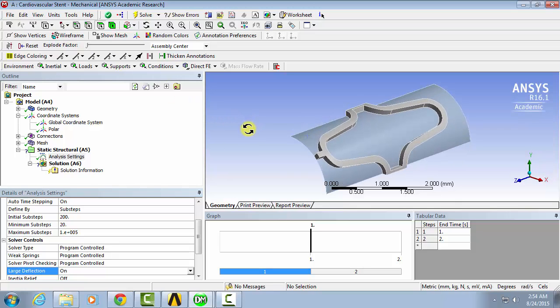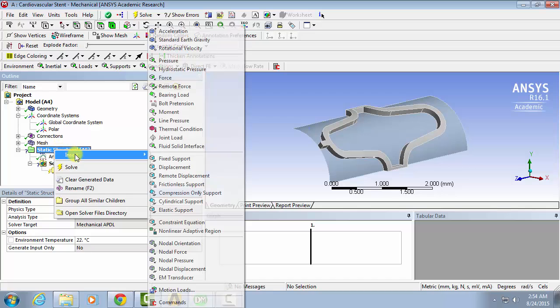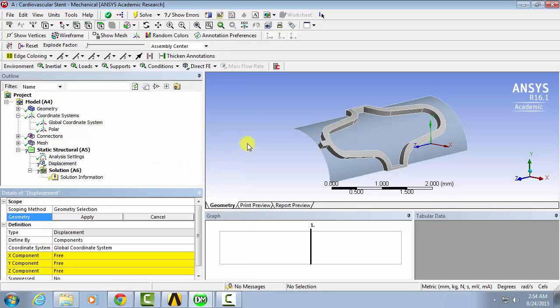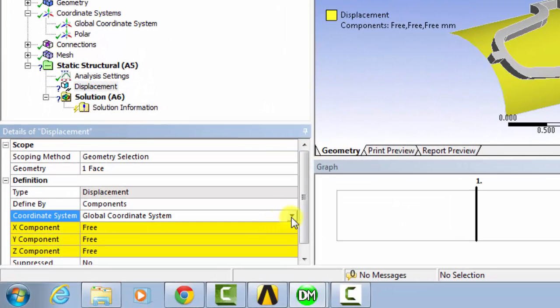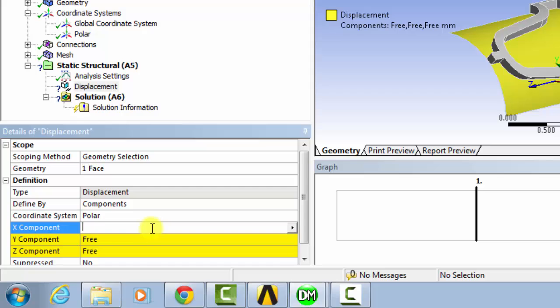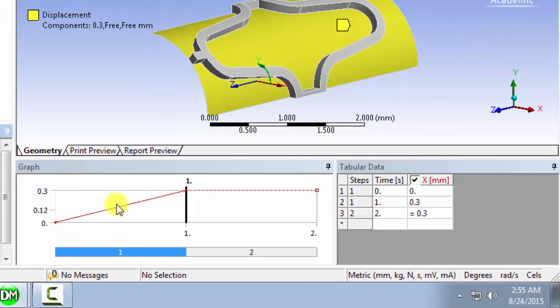So now the problem is ready to be defined by displacements using two different times by splitting it up into a couple different substeps. So we'll right-click, insert a displacement. And because we're expanding the balloon, we'll select the balloon as a geometry for our displacement. Then we can define the coordinate system by our new polar coordinate system. And then we'll select our X component to be 0.3. So you can see from the graph that it'll ramp from 0 to our prescribed displacement. And then right now it stays at that. But we can change that by selecting in the tabular data and then typing in 0. So now the balloon will expand and then contract.